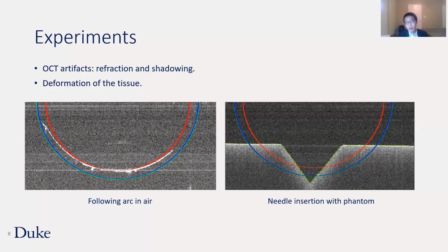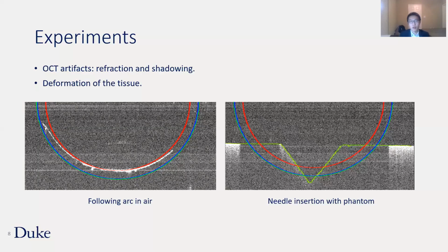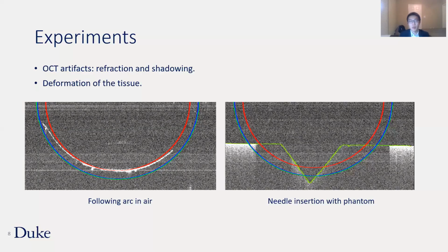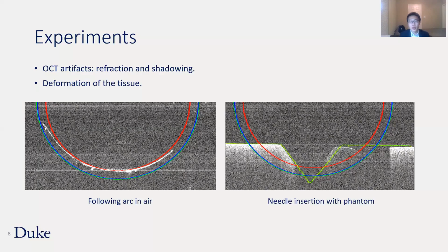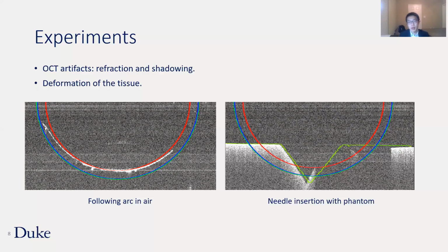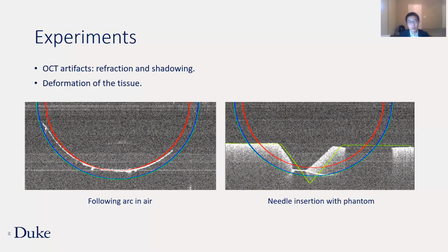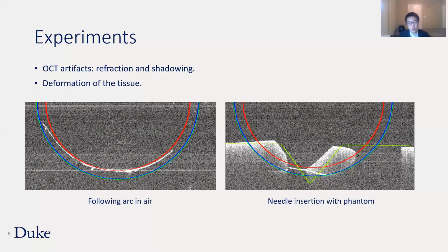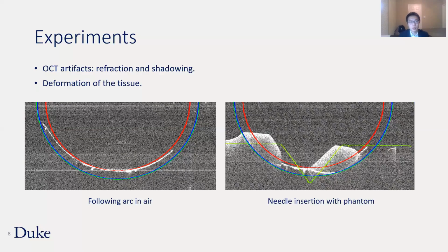Then we let the robot insert the needle into the suturing target. In this video, the suturing target is tissue phantom. During the insertion, the needle driver blocks part of the top layer of the tissue and part of the needle. There's a refraction between the tissue and the air. During the insertion, there's a huge deformation of the tissue, which makes it hard for us to track the movements of the planned entry and exit points.